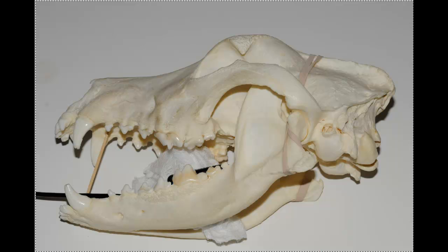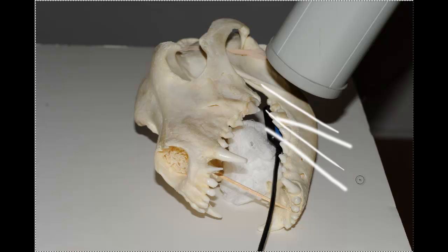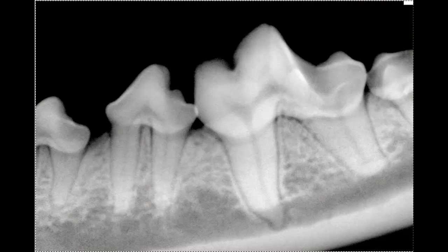Now again, because we're on the cheek teeth, we put the camera around to the front in order to see what angles may be in use here. And we can see that the teeth are about that angle and the sensor is practically parallel, so the end of our cone, everything here is pretty close to parallel. And this would be a result of that shot.